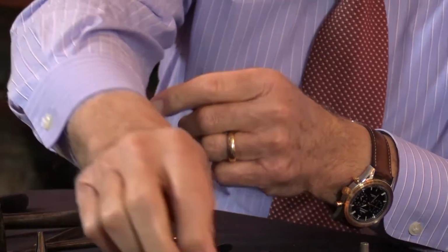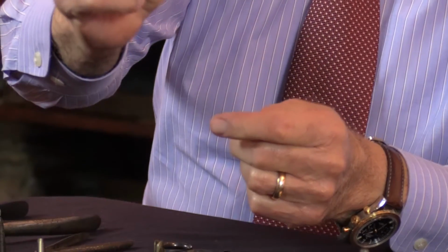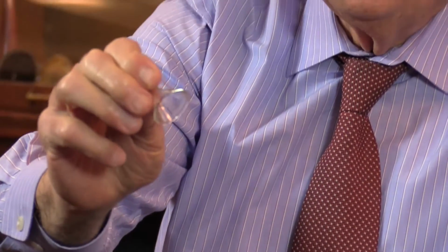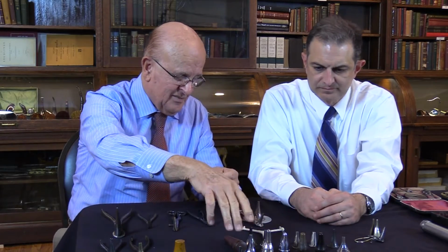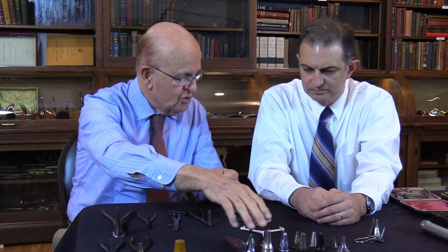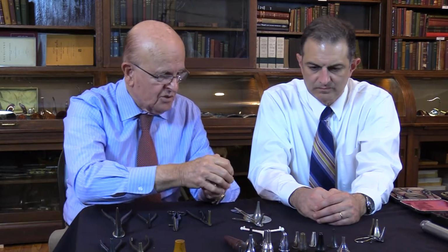The other thing they used is the glass ear speculum. I think that's about 1920, 1930. All of these here are mid-19th century towards the latter part of the 19th century.